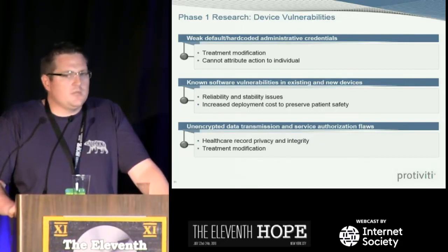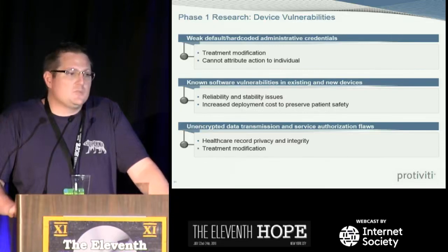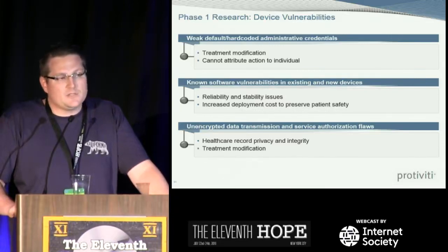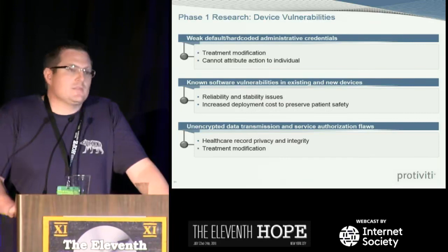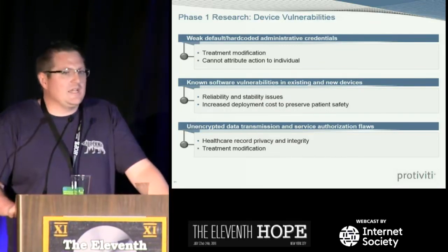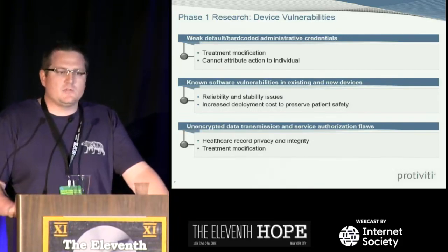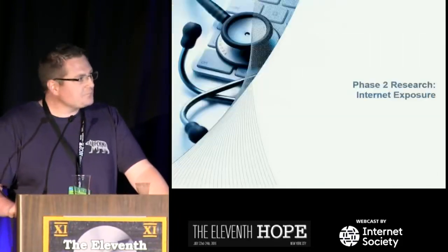So you can man-in-the-middle that. You can alter that data and ultimately cause data integrity issues and push incorrect data into the medical record system. There is research on bad data leading to misdiagnosis and mistreatment, so it's definitely also a safety issue, not just a privacy issue.